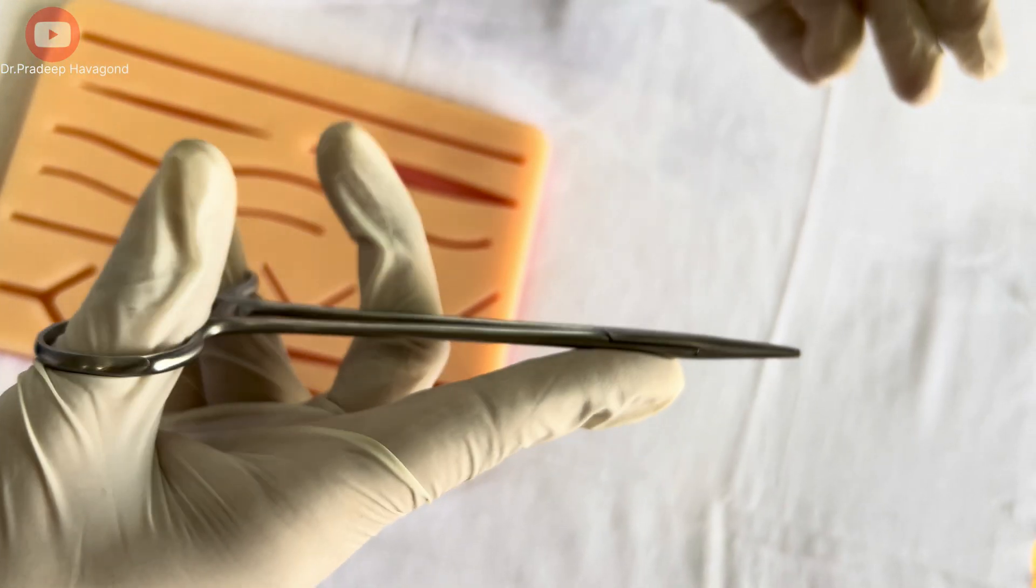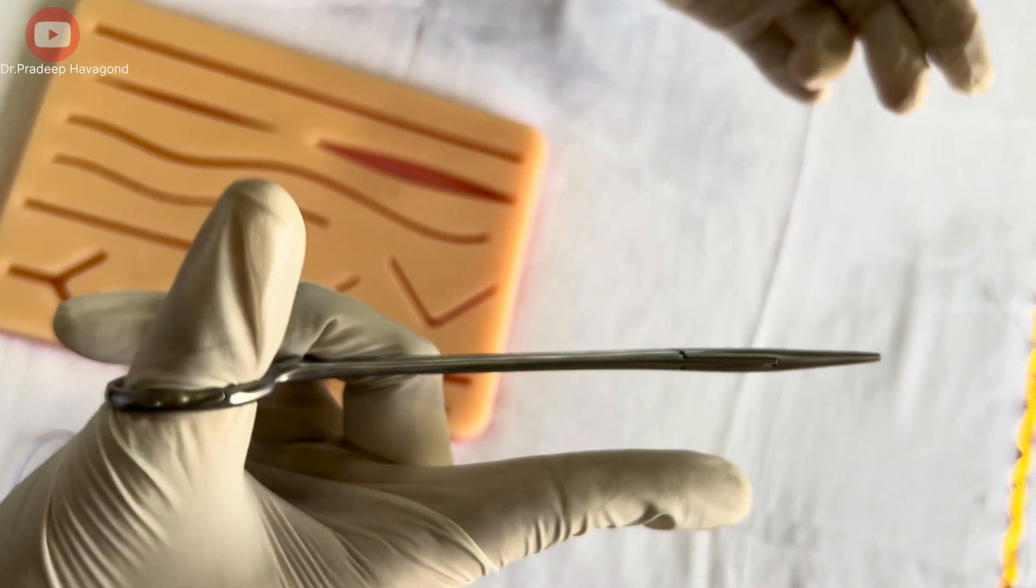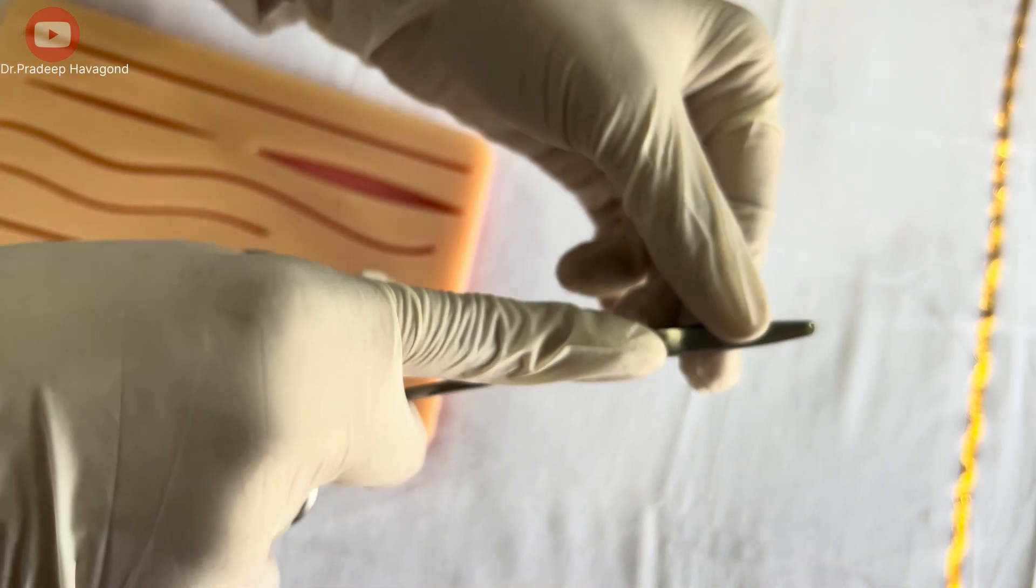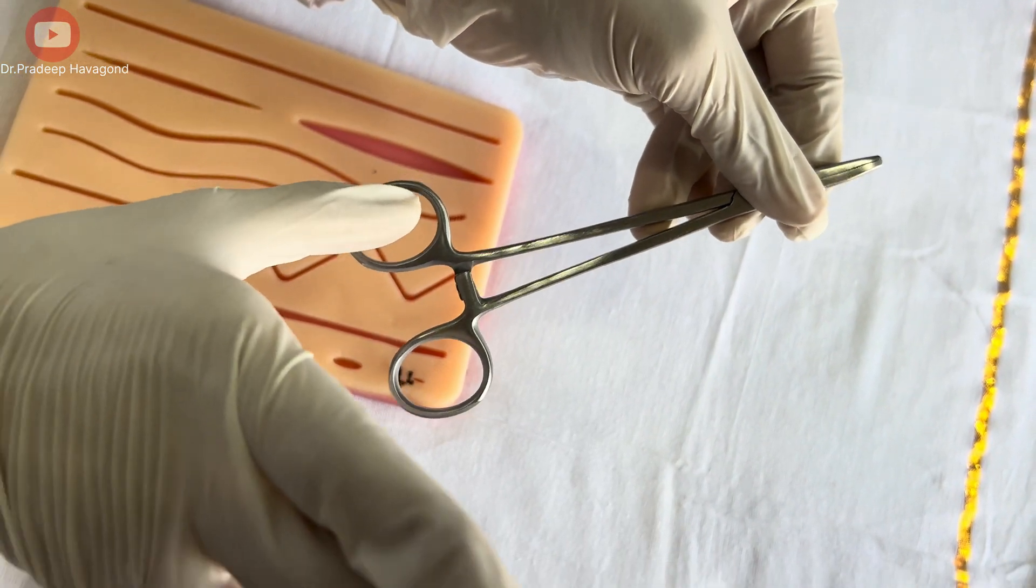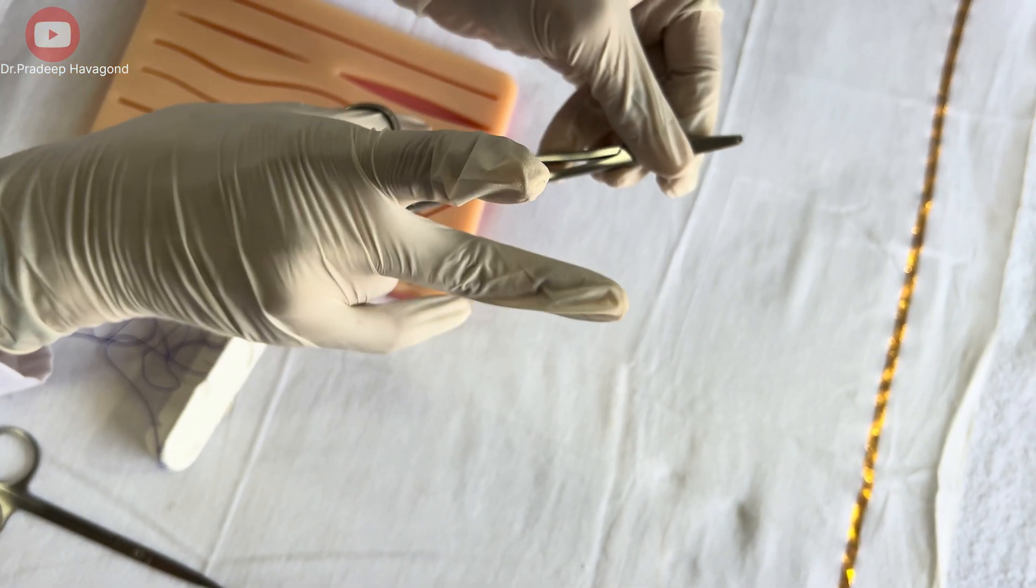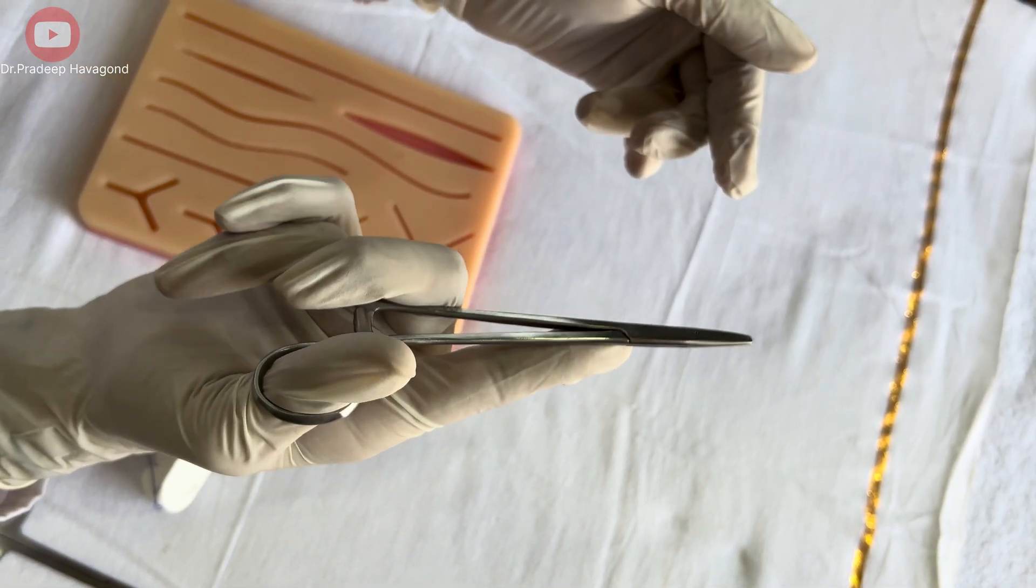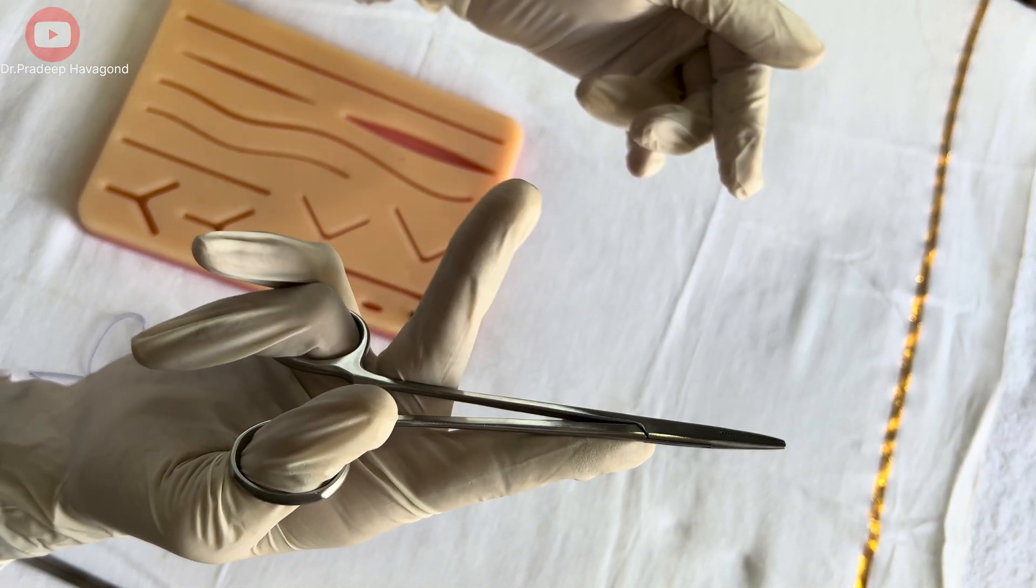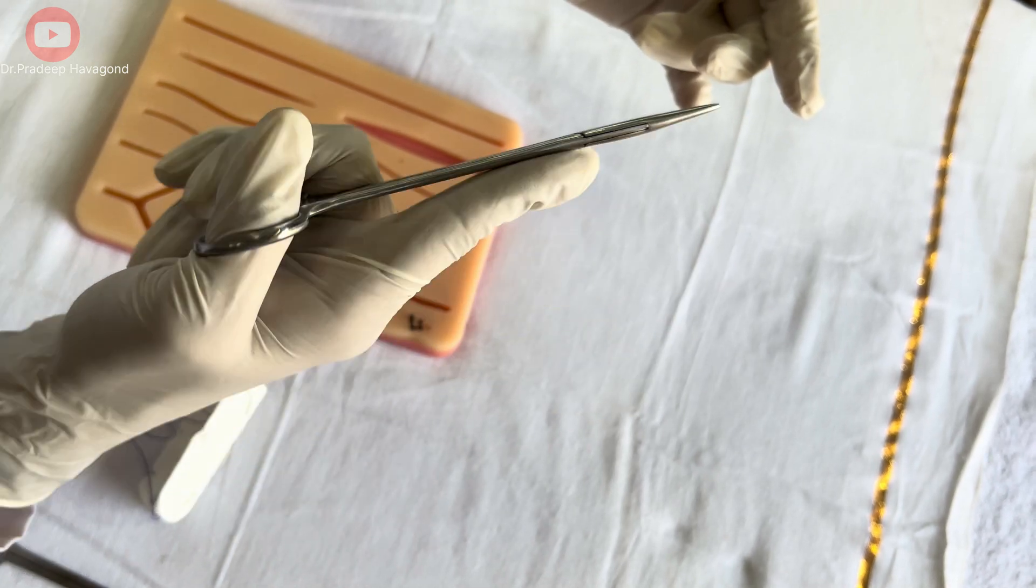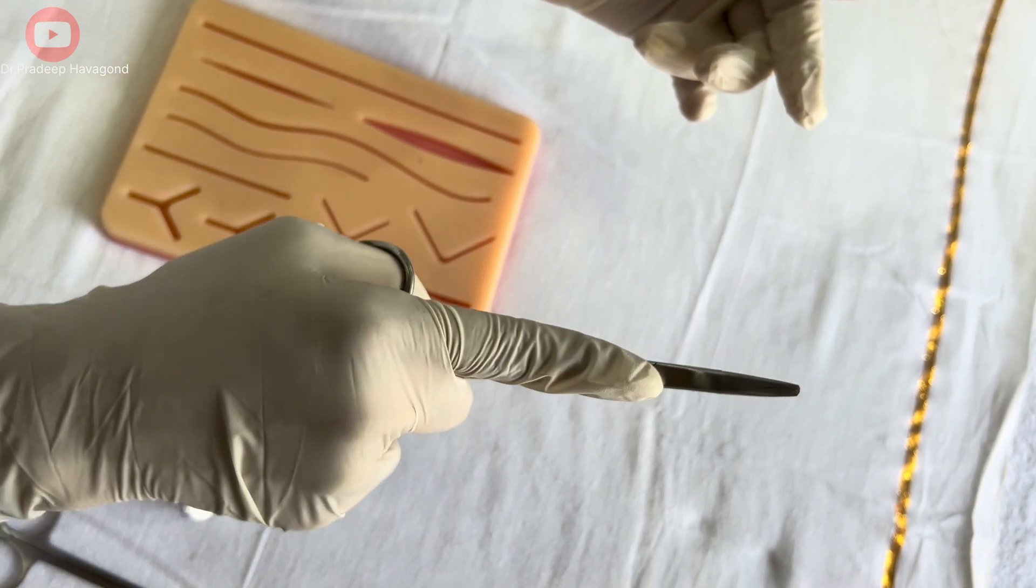First of all, you should know how to hold the needle holder. You have to insert your thumb in the upper loop and ring finger in the lower loop. Index finger will stabilize the needle holder from the side, and the middle finger will stabilize the needle holder from below.